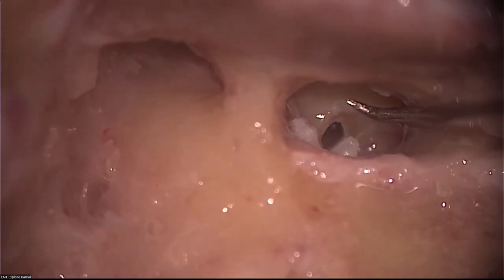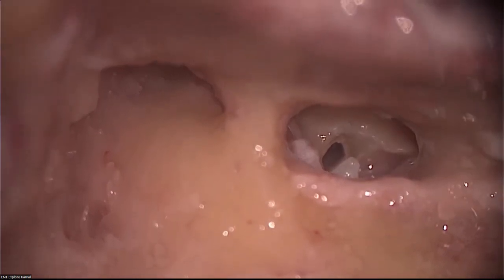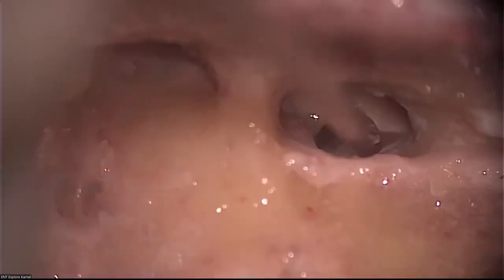If you drill anterior to the round window, this is the region where the basilar membrane is running. Try to understand: never ever try to drill anterior to the round window. I will tell you exactly where the basilar membrane is coming when we open up.